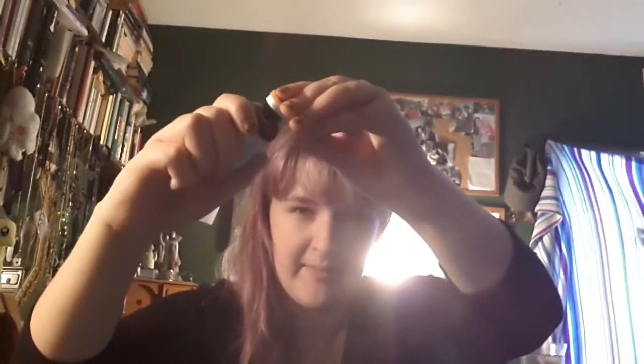You see the cap? You pull the cap off like that, and that can just be thrown in the trash. Then you see the little rubber seal on the inside there.